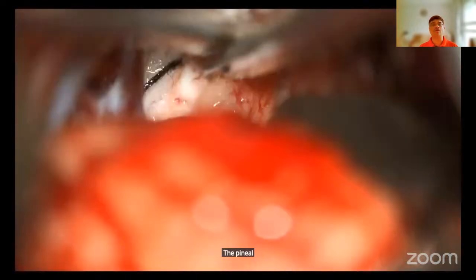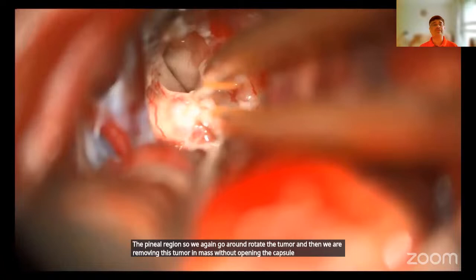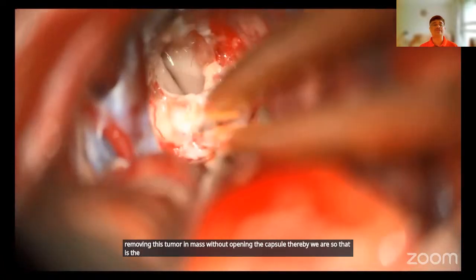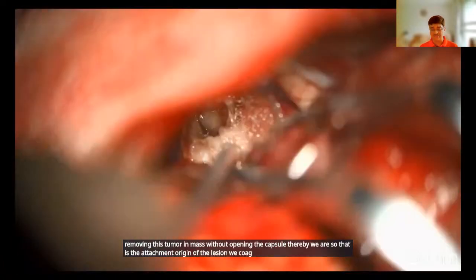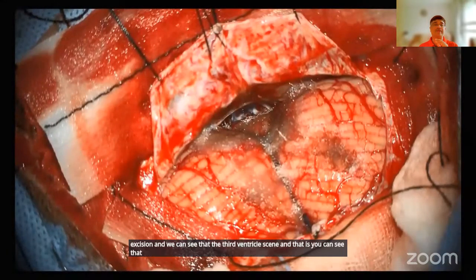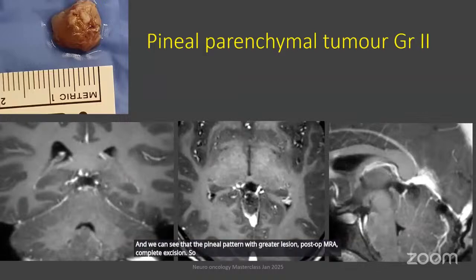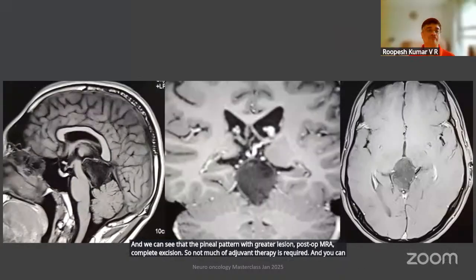So we again go around, rotate this tumor, and remove this tumor en masse without opening the capsule, thereby we avoid spillage. That is the attachment origin of the lesion, and we are coagulating it. So this is a gross total excision, and we can see the third ventricle, and that retractors were not used. Our suction acts as a dynamic retraction, and then we work out. This is a pineal parenchymal grade 2 lesion, post-op MRI, complete excision. So not much adjuvant therapy is required, and you can see the child at follow-up.